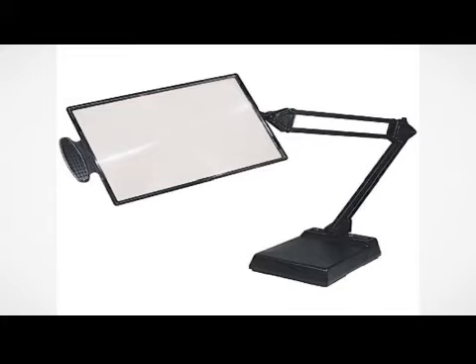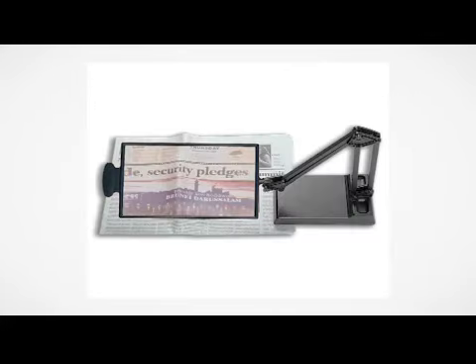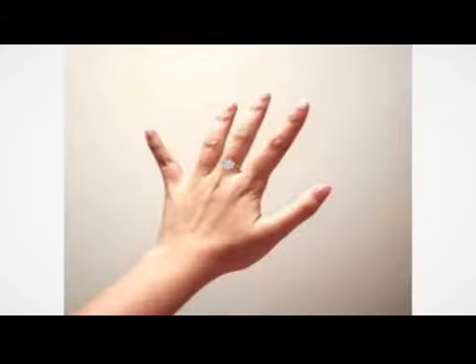Stand magnifier. Place the stand magnifier with the legs down flat on the page at the beginning of the paragraph. Move the head as close to the lens as needed to get a clear picture and the widest field of view. Move the magnifier slowly to the right while reading, keeping it flat on the page. At the end of the line, move the magnifier back in a horizontal movement to the beginning of the line. Move down one line, start reading the new line. Fingers can be used as a help to locate the next line.